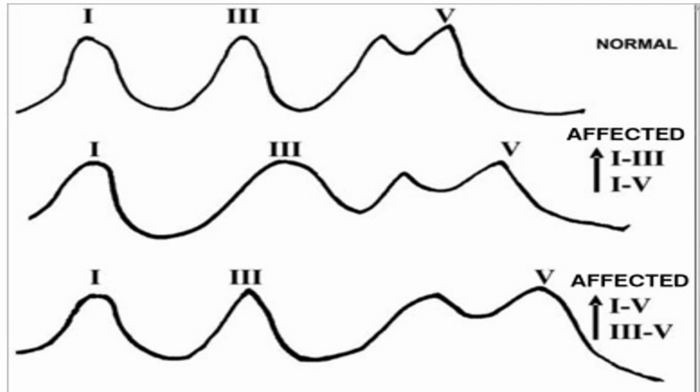On comparison of the interwave latency, basically to check the interwave latency, simply see the distance between the two waves in the plotted graph. Clearly, if we compare the topmost image with the second image, there is a big gap between wave 1 and wave 3. So there is prolonged interwave latency of wave 1 to 3, and also between wave 1 to wave 5. We are comparing the second graph with the first graph. Okay, so here is increased interwave latency.